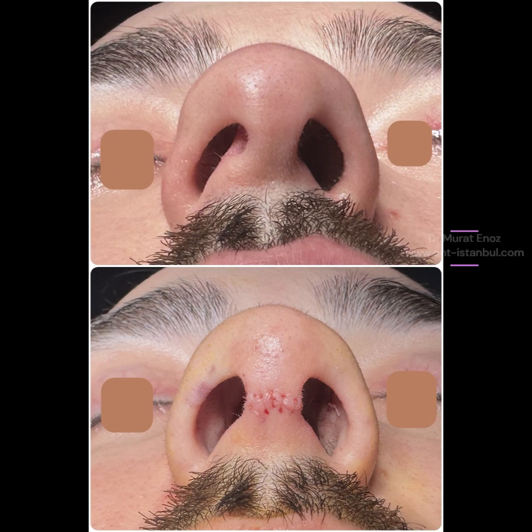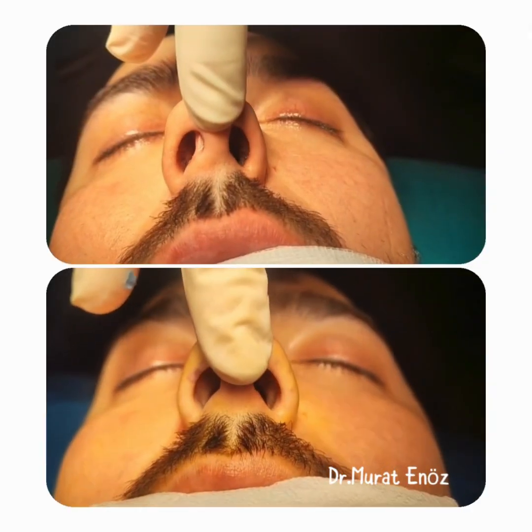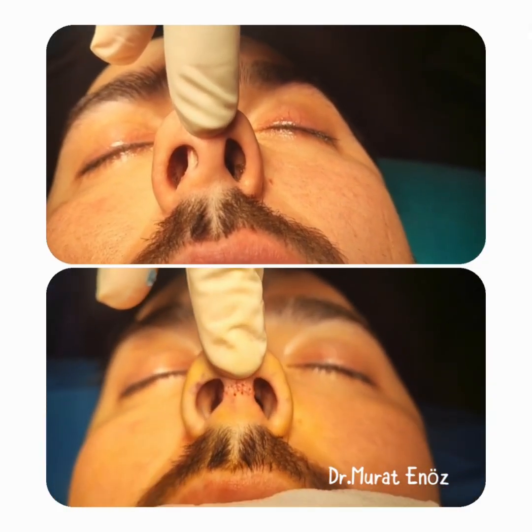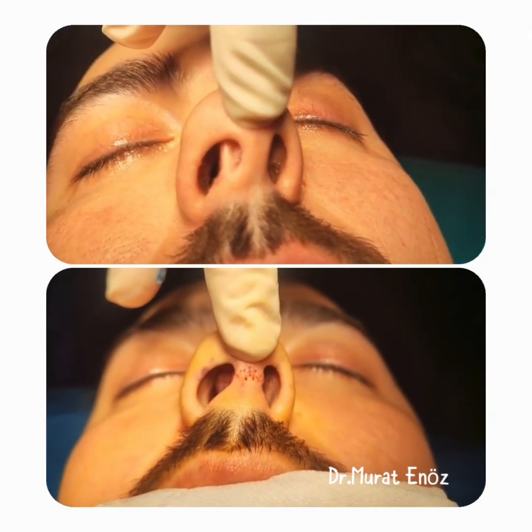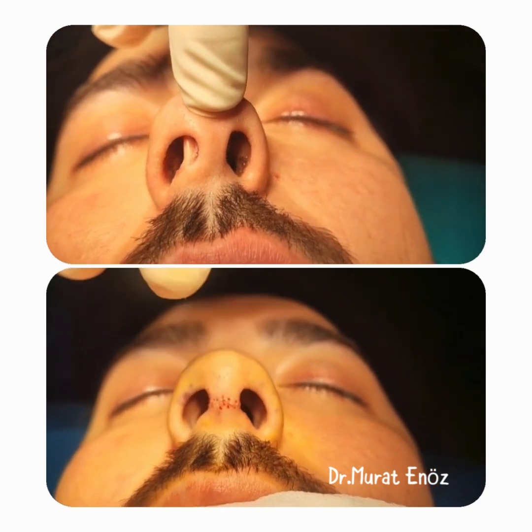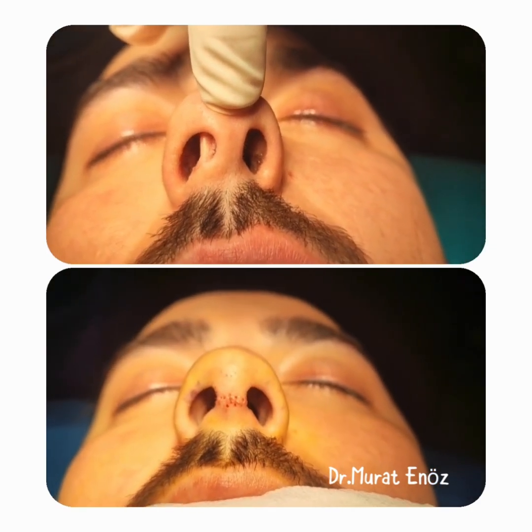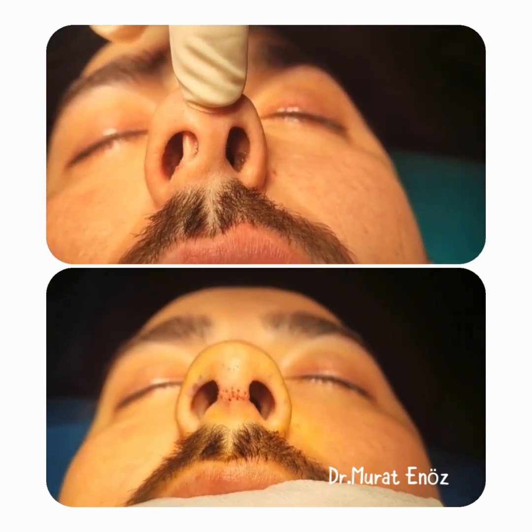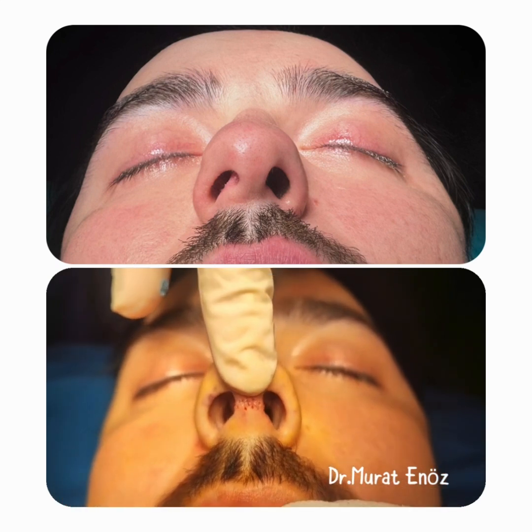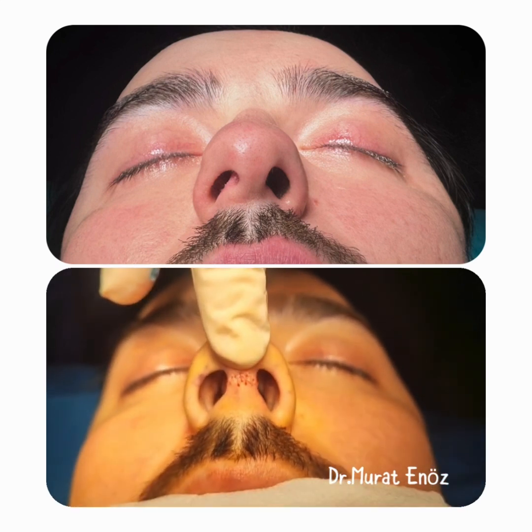allowing the surgeon to lift the nasal skin and gain direct access to the nasal septum. The open technique provides better visibility and precision, making it especially useful for complex or severe deviations.